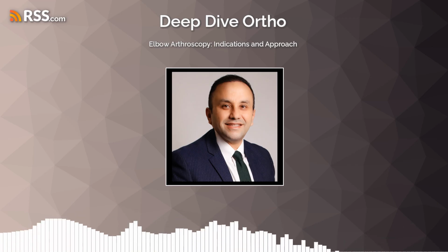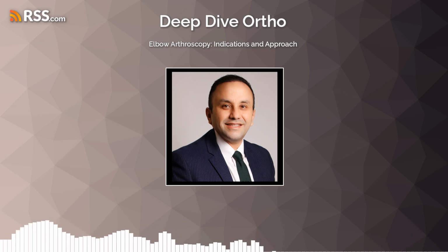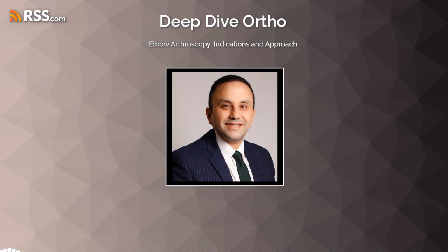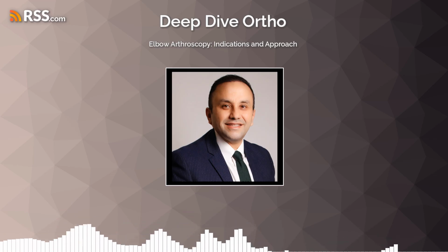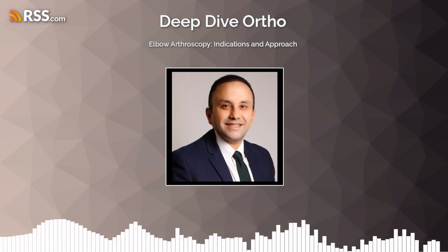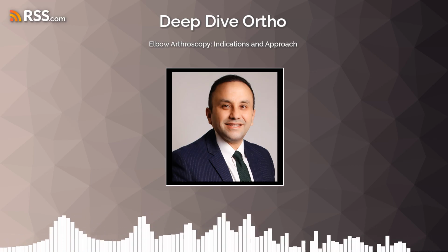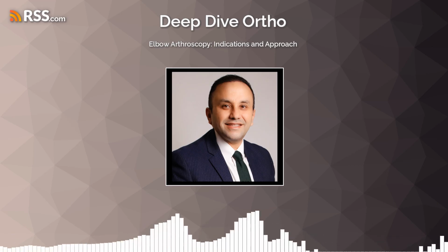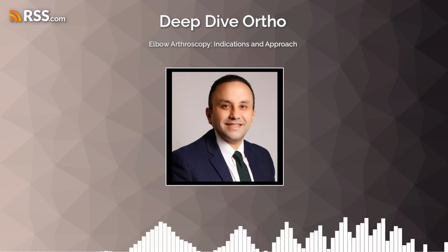Distending the joint capsule with fluid significantly increases the bone-to-nerve distance, creating a larger and safer working space within the joint. However, it's crucial to remember that this fluid distension doesn't change the capsule to nerve distance, meaning the nerves still remain in close proximity to the capsule itself, so vigilance is key. Okay, so space between bone and nerve, but not capsule and nerve.